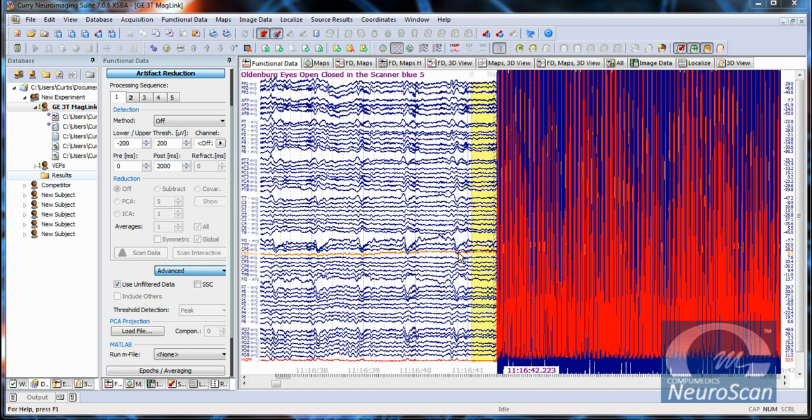gradient artifact, number one, I have found that if we do a combined method of PCA first plus, pardon me, plus the traditional Allen method of subtraction second, we can get an even cleaner suppression of the gradient artifact than we do simply using the Allen method alone. And I will walk through these steps right now.